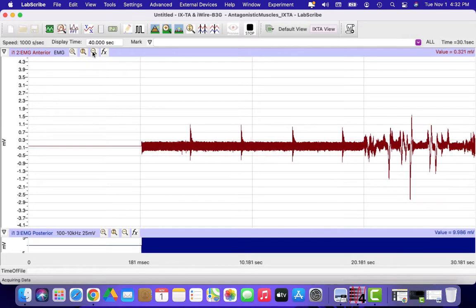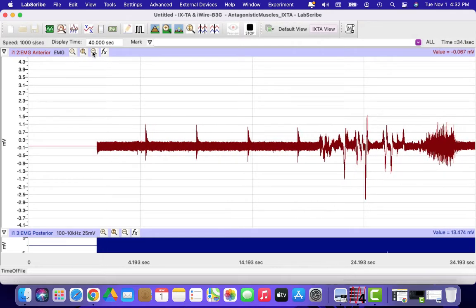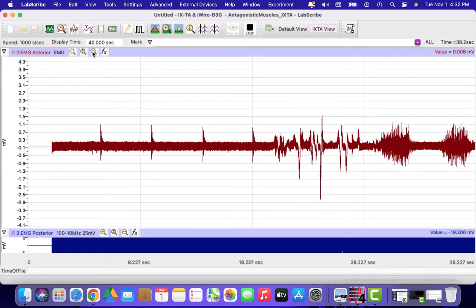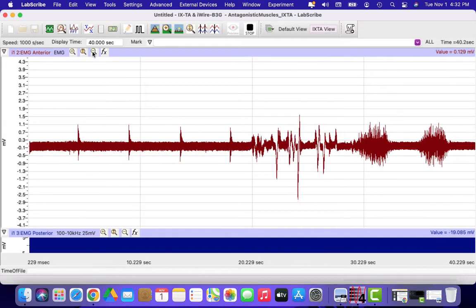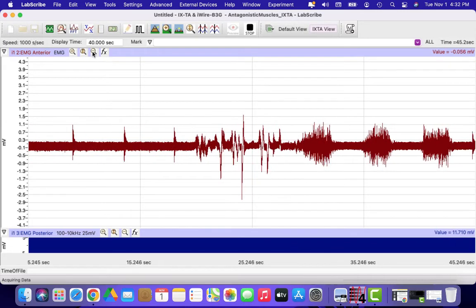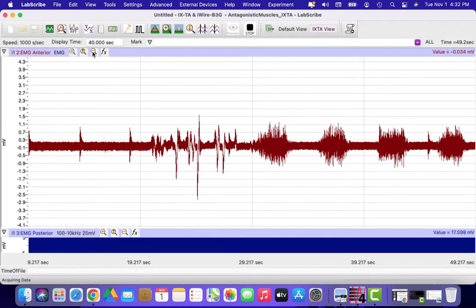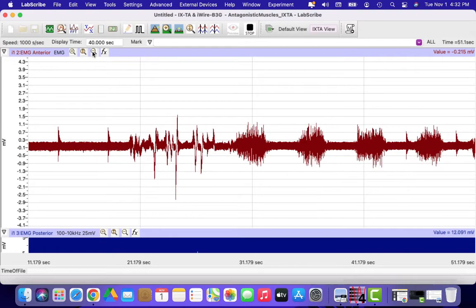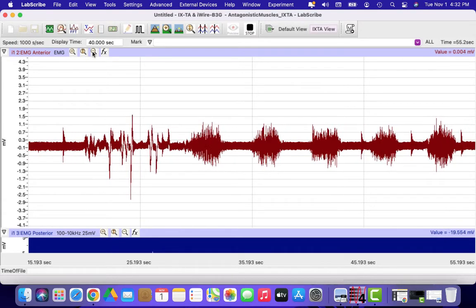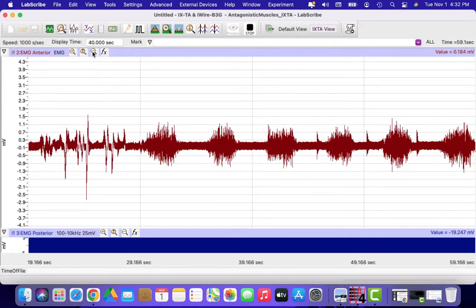I'm also picking up some noise on my tracing just because I'm moving around, so any movement is going to be picked up on your EMG. But then you can see I'm starting to do some very specific flexion contractions of my forearm flexors. You can see those bursts of activity with a quieter period in between — this is what we want to see, so we can identify when the muscles are turned on and then rest periods in between.